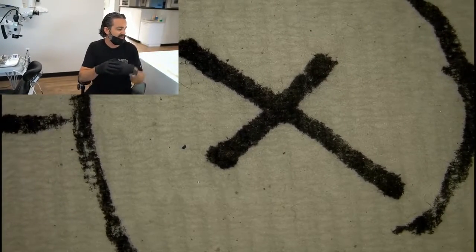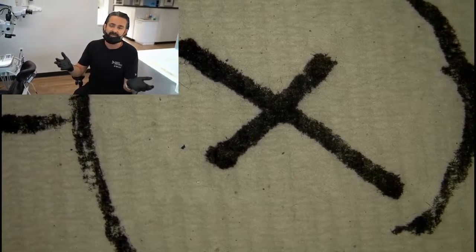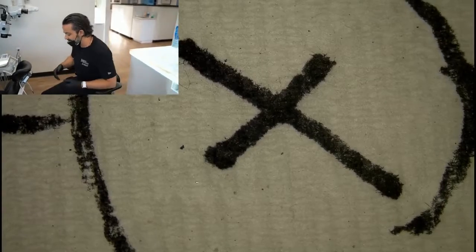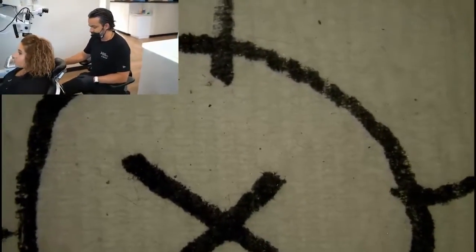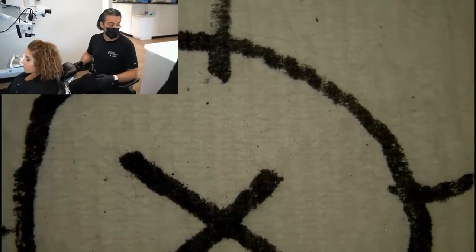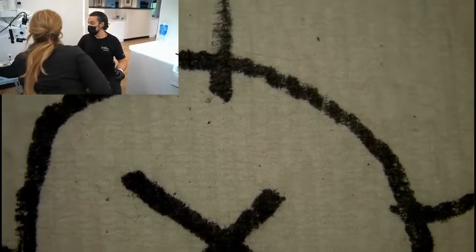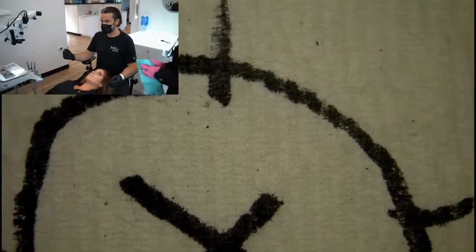Now, examinations. Let's go back to examinations. Let's actually do an examination and see the power of a microscope. So, Lindsay, let's get back into position. You can just use that over there. Do you want to get a patient napkin too? Alrighty. Good old mirror and explorer.